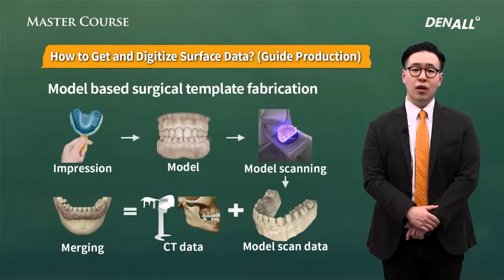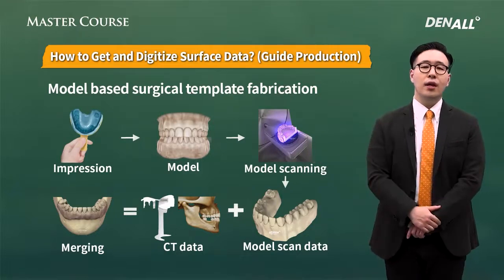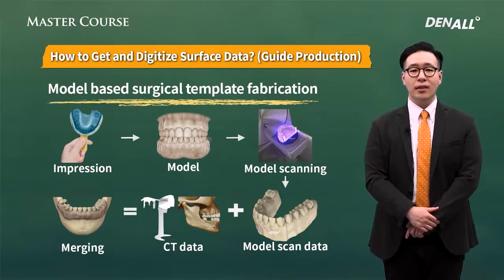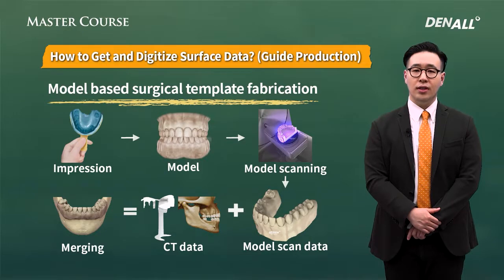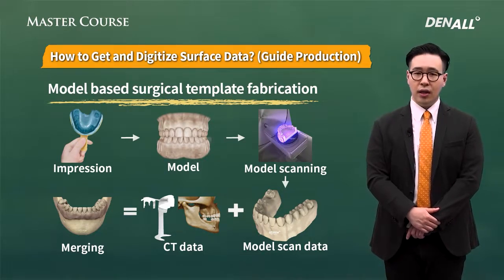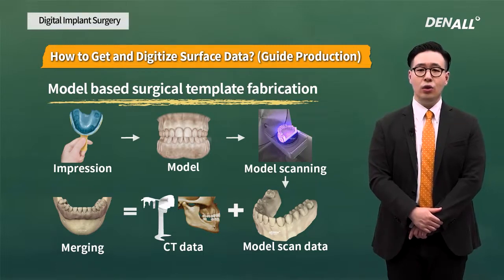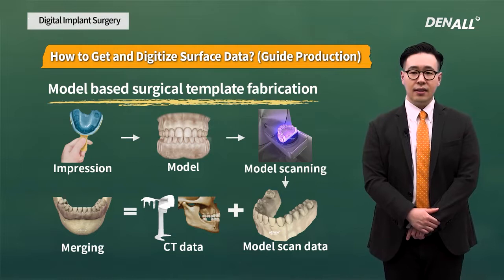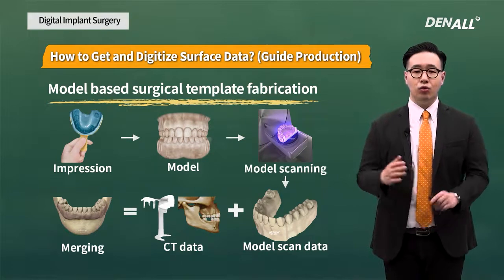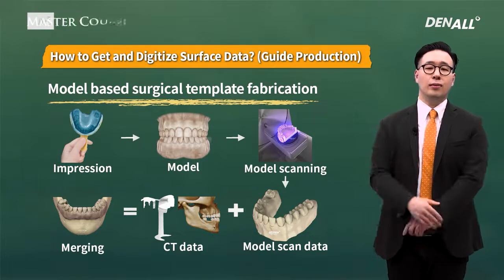And if you don't have an intraoral scanner in your office, after analog impression taking, a model is made to be scanned with a model scanner. Then analog scan data is converted to digital scan data. When occlusion is completely collapsed or in a completely edentulous patient, first I do impression taking and take interjaw relation, and then I convert the data into digital.